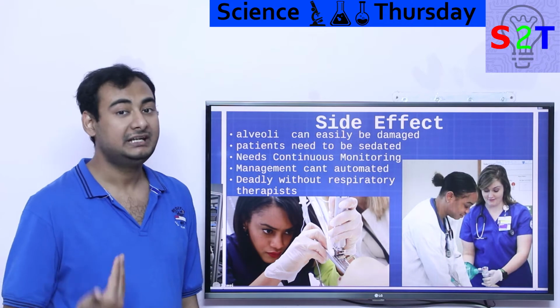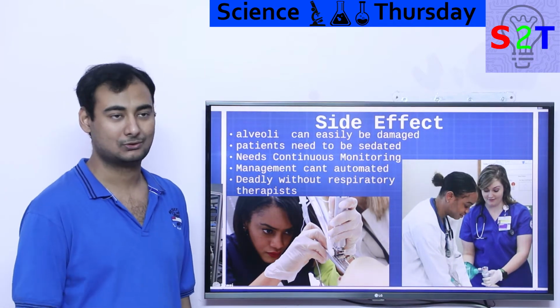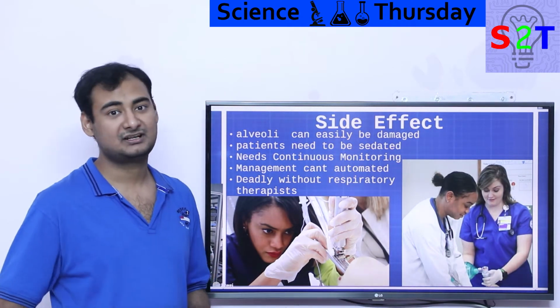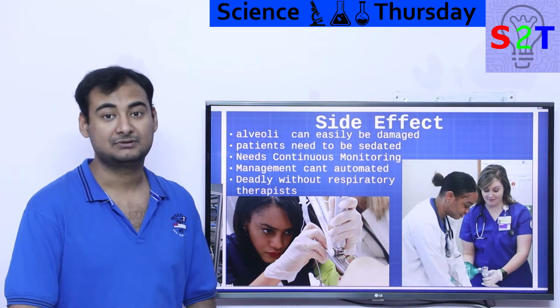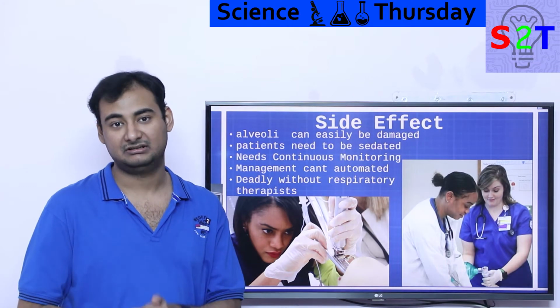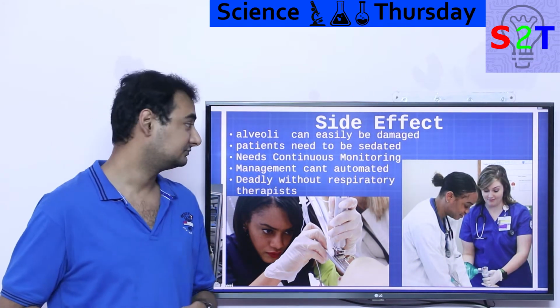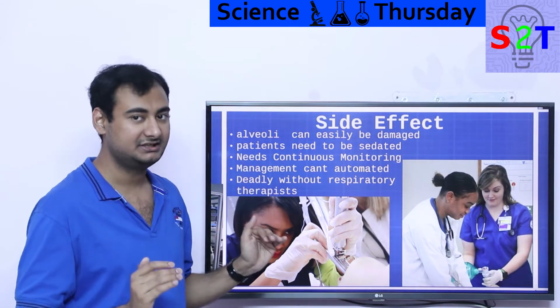Again, alveoli are way too fragile. It's not like your muscle, where it's going to heal and get stronger as you grow older. It's very fragile. In many regards it's much more fragile than your other organs, so it can be easily damaged. And you must have heard people already saying their horror stories, like their lungs are damaged because of the ventilator. If the ventilator setting is wrong, it's literally damaging your alveoli. So that's something a person has to take very serious care about.